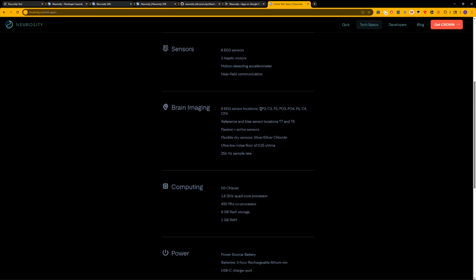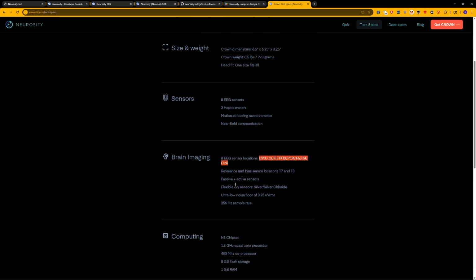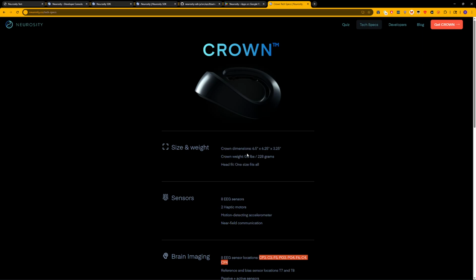mostly that it had 8 sensor locations across a large part of the head. These are EEG-like dot positions. It's also sort of all built in and stuff like that. I was looking into OpenBCI hardware, and it was about the same price as this, and it's all built in. So there we go. It's actually got a compute module on it, which means it's doing work.